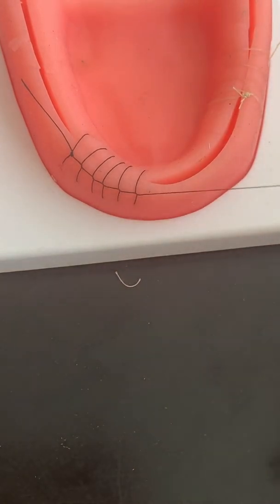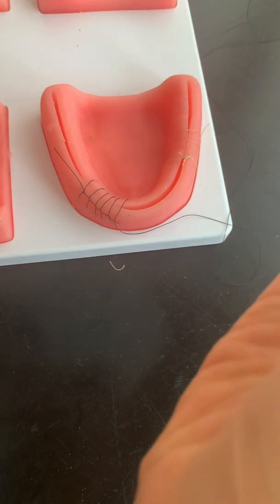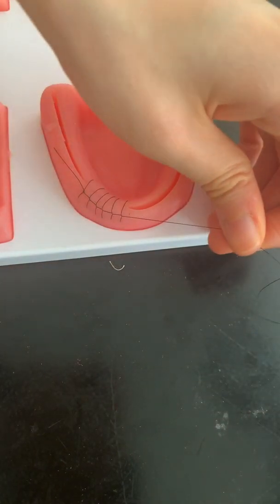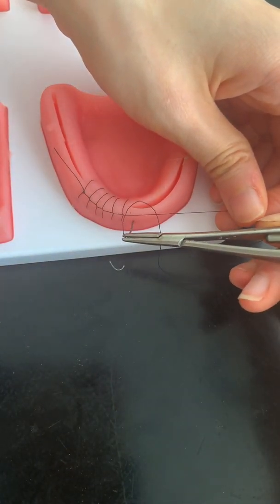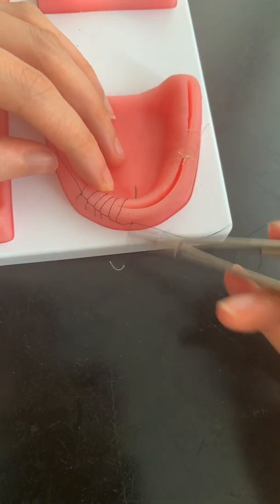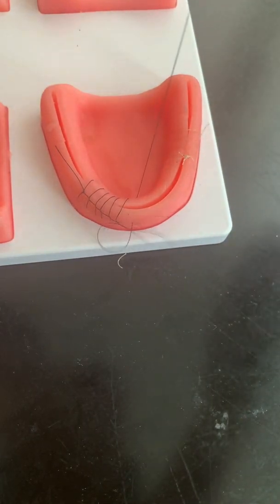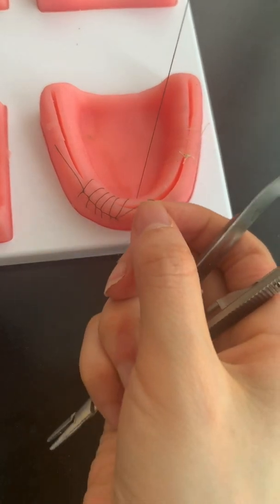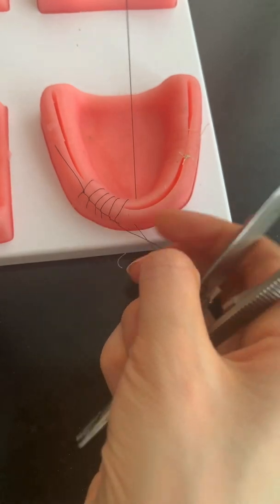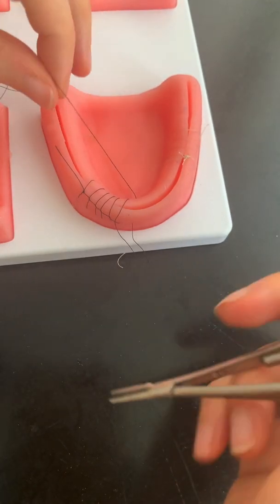Now I'm really going to tie it off — I can continue this forever. So let's tie this baby off. Go in again, let's see where the entrance is around here, and out. So how you want to end it is you see this as a loop. Pretend that it's one string and you tie it off to the loop.